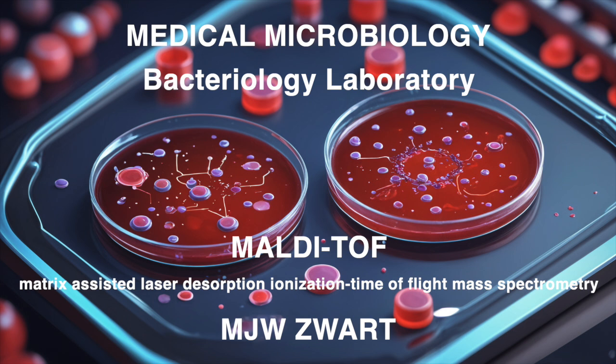Exactly. So for those who might be new to this, what even is MALDI-TOF? Why is it such a game changer in microbiology? Okay, so MALDI-TOF stands for Matrix-Assisted Laser Desorption Ionization Time of Flight. It's a mouthful, I know. But basically, it's a way to identify microorganisms based on their unique protein profiles. It's kind of like a fingerprint.